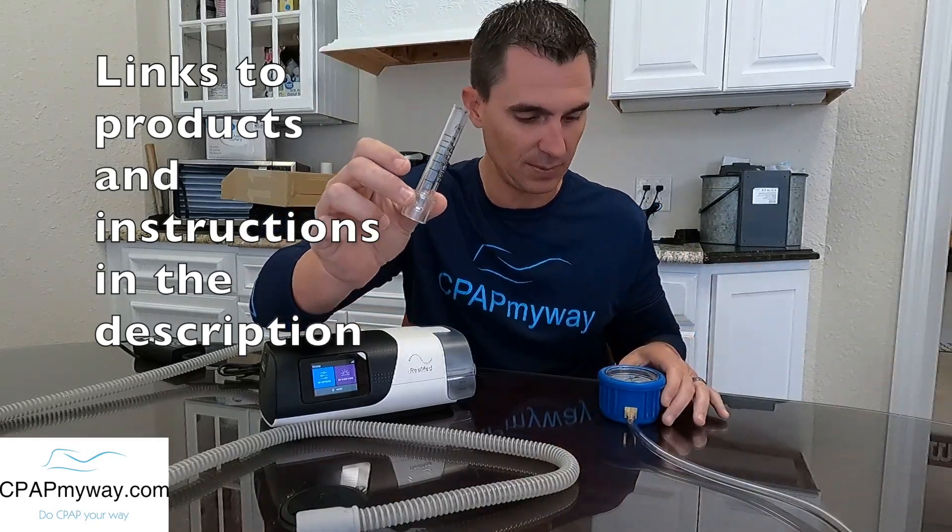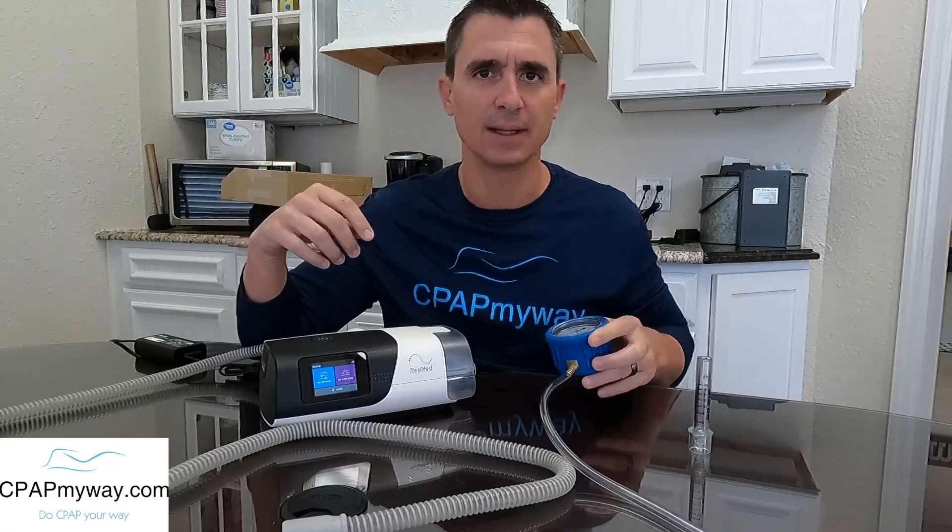The CPAP pressure is measured in centimeters of water pressure displaced. There are old-school tubes that have water in them — as you blow pressure in, it pushes the water up in the gauge. These days there's a much easier way: we have this little home-use manometer and a more professional manometer that we use here.